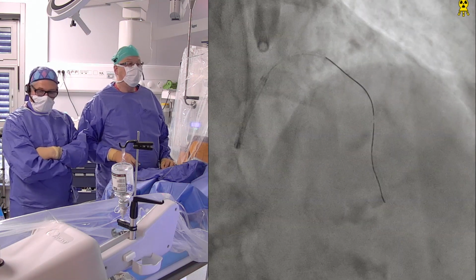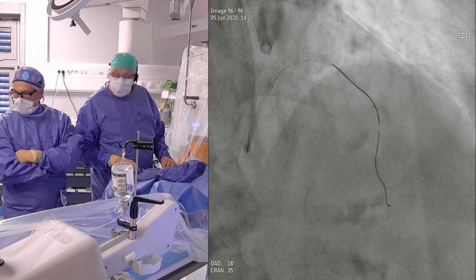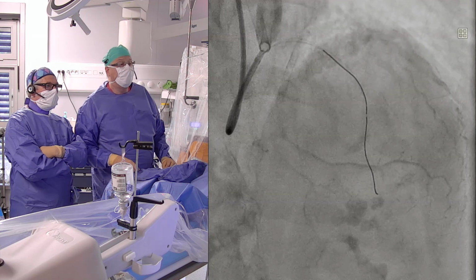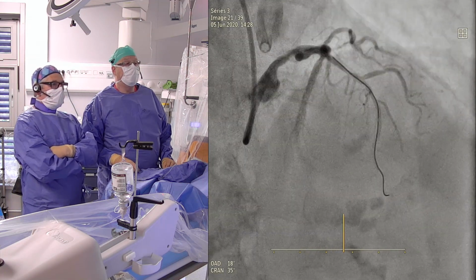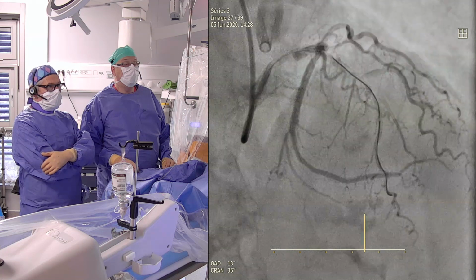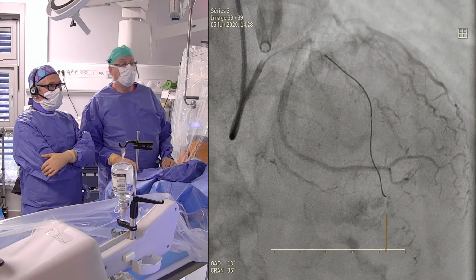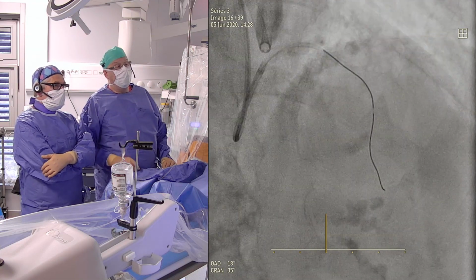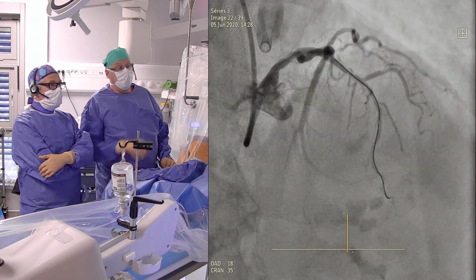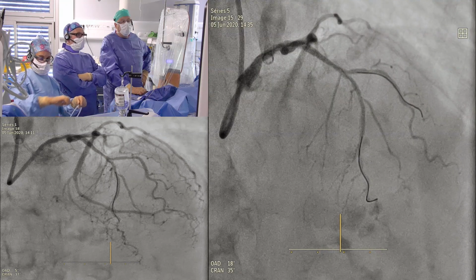Okay. I think we are more or less where we can make a movie like that if you want. Yeah, okay, we can make an angio like this. Okay. So the radio-opaque part of the wire is 30 millimeter. We plan to cover from the LAD up to the proximal lesion. I think the distal tip of this wire is approximately where we plan to land. Yeah, so 28 will be okay? I think 28 should be okay because we have some room in the proximal part. I agree. Okay, so I will keep the strategy of 28.